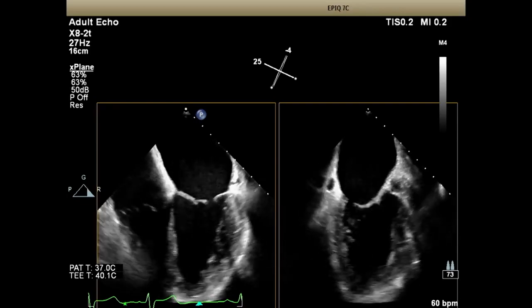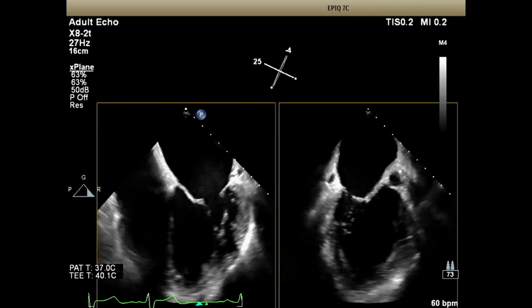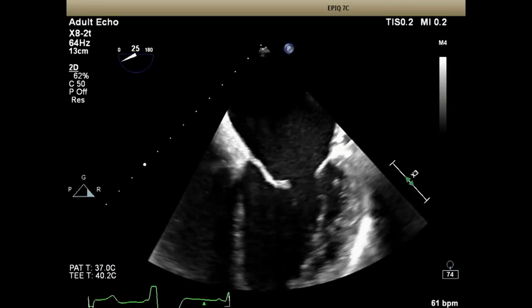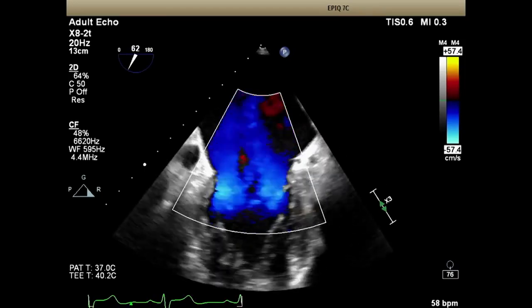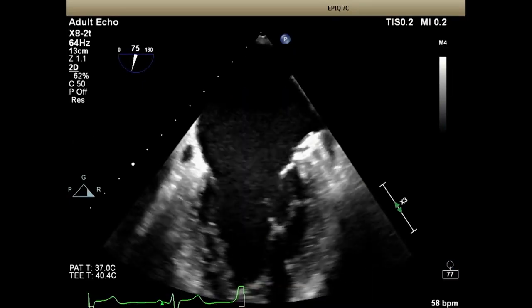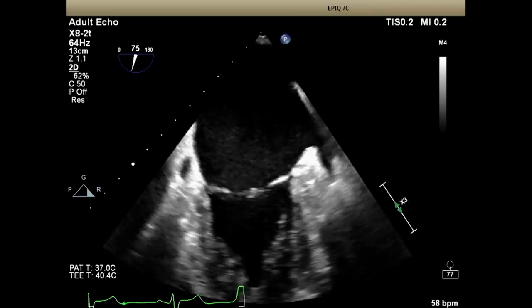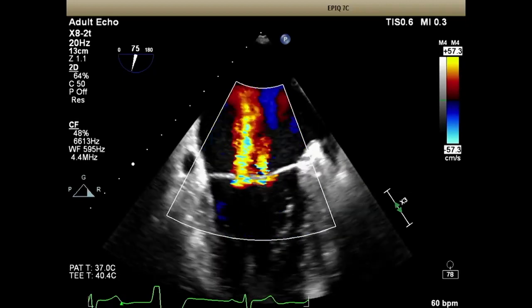So, first thing that we see is that the dilated cardiomyopathy patient's ejection fraction is moderately reduced, about 45%. And you can already appreciate that the valve leaflets are restricted, and we see it a little bit better here. There's pretty significant MR, from the entire coaptation of the A2, P2. And we can look more closely at the valve. This is an important view. This is the intercommissural view, where we can see the A2, P3 scallops, and define exactly where the MR is coming from. Again, looking at this, we can see that this is from the entire A2, P2 coaptation.